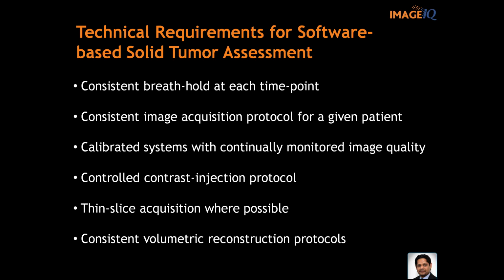Right. That's a really good point. It's really important that when you set up these trials, you are actually putting thought towards the imaging portion of it too, not just recruiting patients and making sure that they're staying on their drugs and coming in for their normal assessments. You want to make sure that the imaging part of it is also controlled, that you have site qualifications, that places are trained and they're performing things in a rigorous way so that you can apply things like automated software to it.